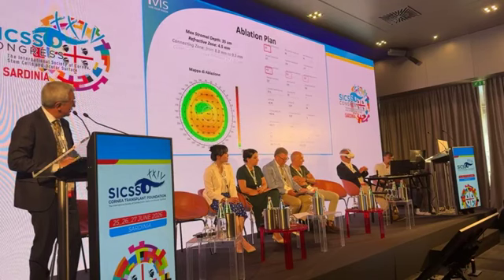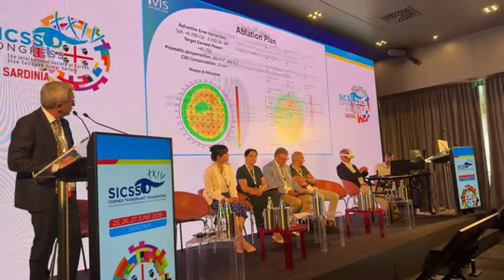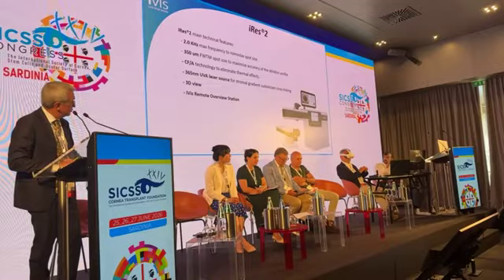The laser that is going to execute this ablation is a 2 kHz system with a spot size of 350 micron. You will see from here, this is the post-op. Professor Alessio, through this visor, will control in the center the 3D vision of the platform, on the right the ablation and the command of the laser, and on the left the software for planning. So, Professor Alessio, if you want to start.